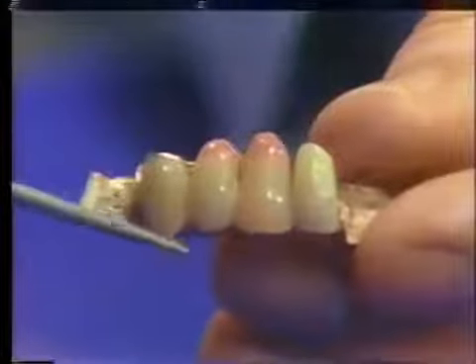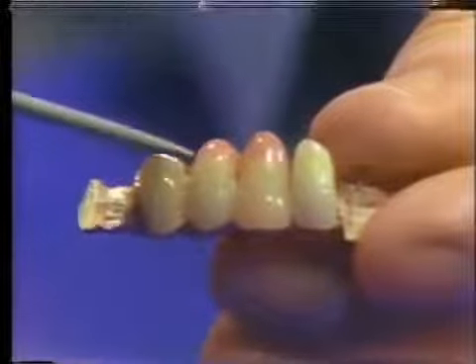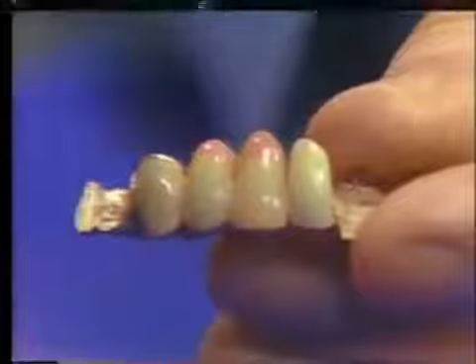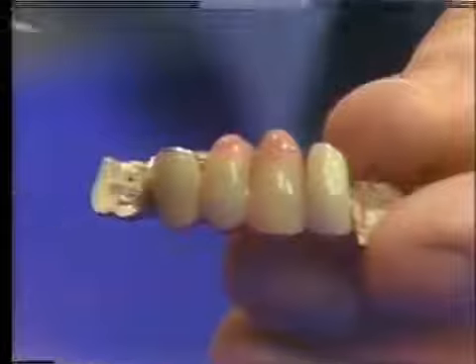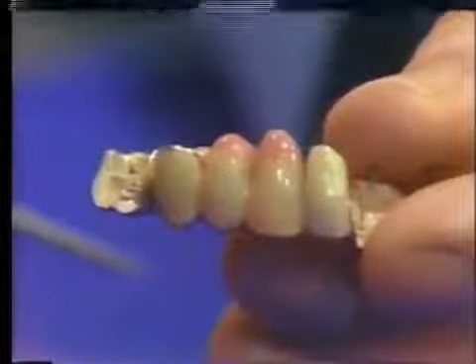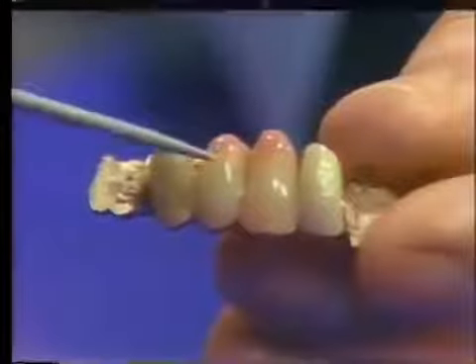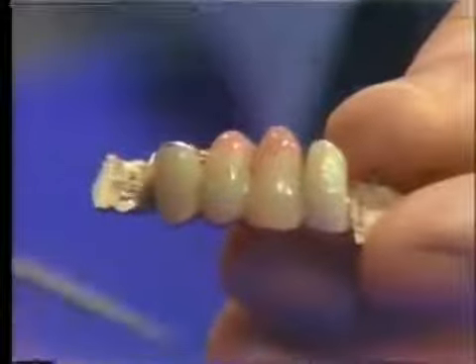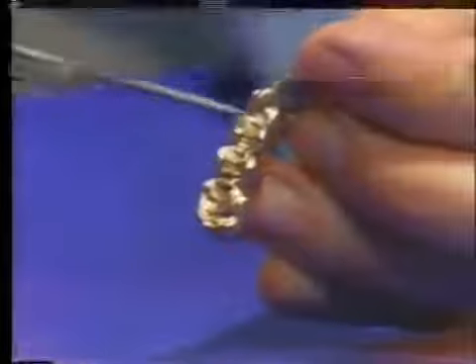It's sometimes done in a long Pontic facing of this nature to place a little pink porcelain which is fused on at the top end here, in order that this part of the Pontic blends in with the gingival tissue and gets lost. In the mouth, that looks a little pinker than it does on this TV screen, and there is a fairly definite boundary between the pink and the porcelain, so that it tends to reduce the overall length of that particular Pontic. You can see, I think, on the occlusal surface of this tooth here that we've got adequate gold protection of the porcelain.